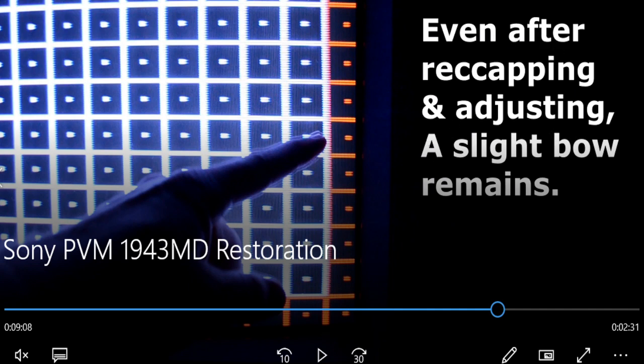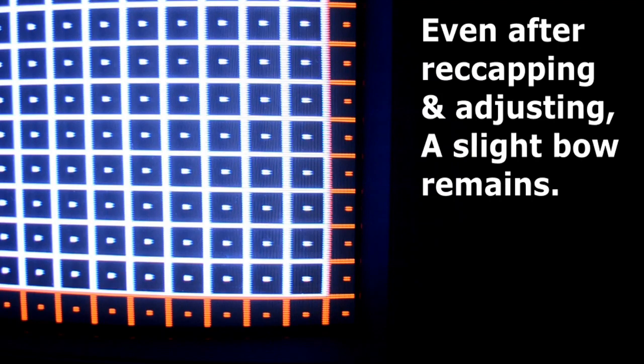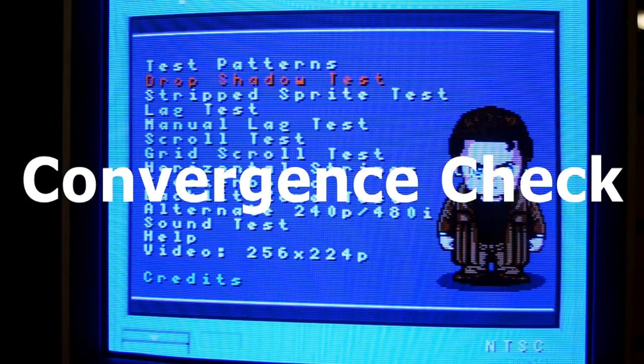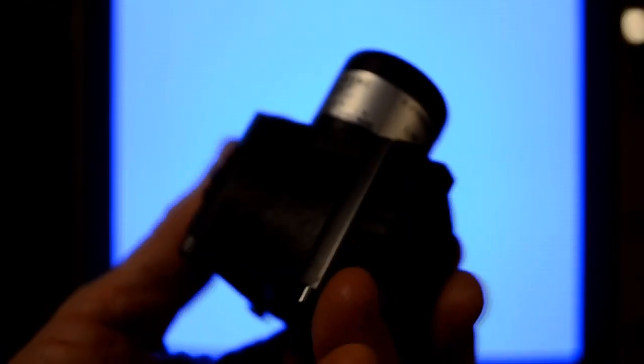Even after recapping and adjustment, I could still not get rid of this screen bow in the bottom right-hand side of the monitor. I couldn't get rid of that little bow no matter what I did. So sometimes you're just going to have to live with a little bit of flaws in your screen, especially for a tube that's 30 years old. Let me show you this CRT convergence tool today. It's this Klein optical lens.